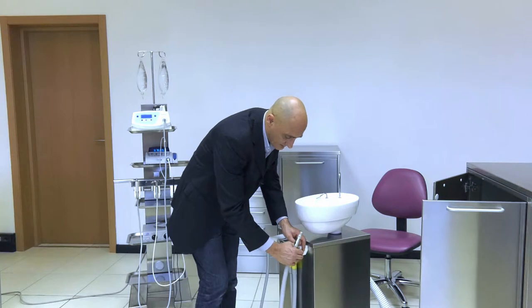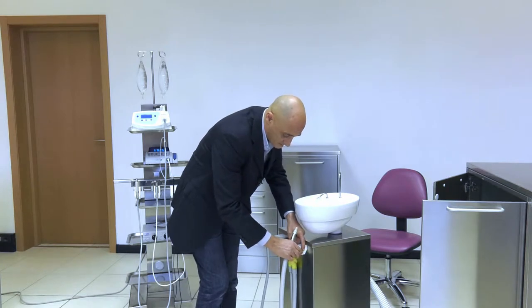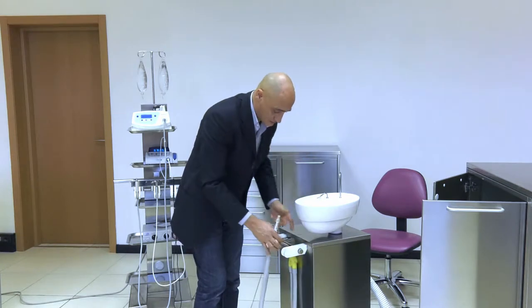The 2 supports can be sterilized and cleaned in an autoclave unit. As you can see, it is a fairly quick and simple operation.